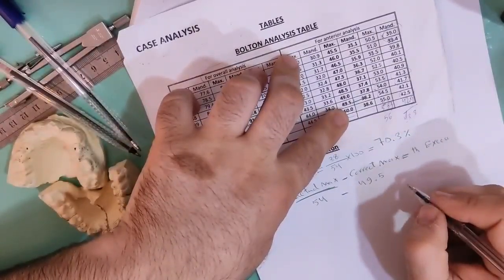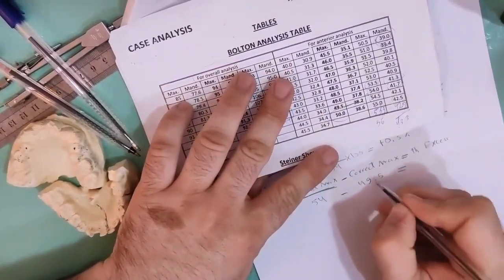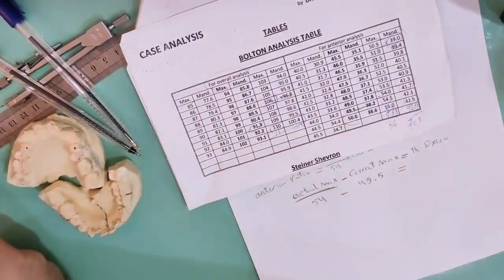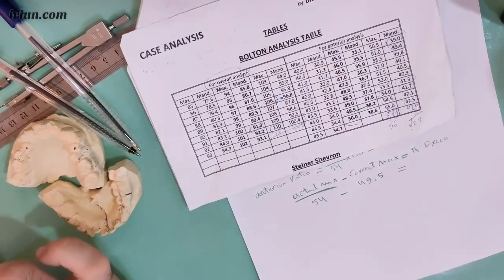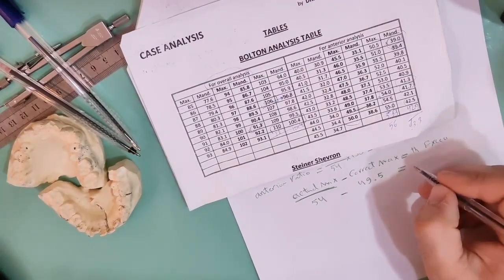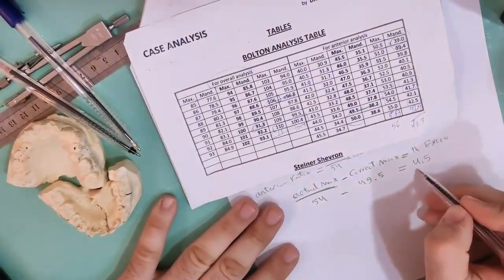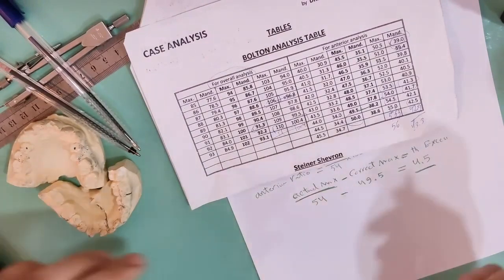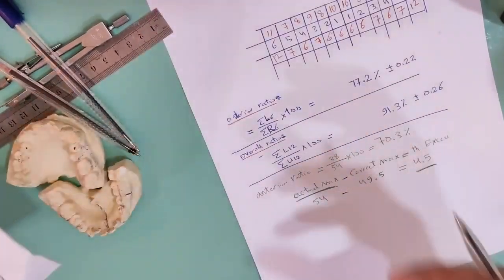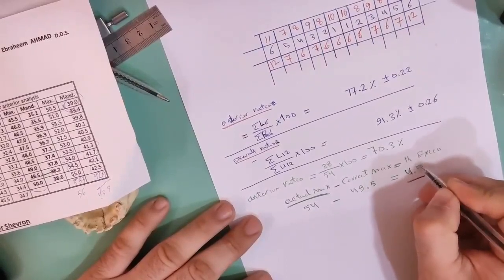So 54 minus 49.5 equals 4.5. 4.5 is the excess volume for the anterior 6.